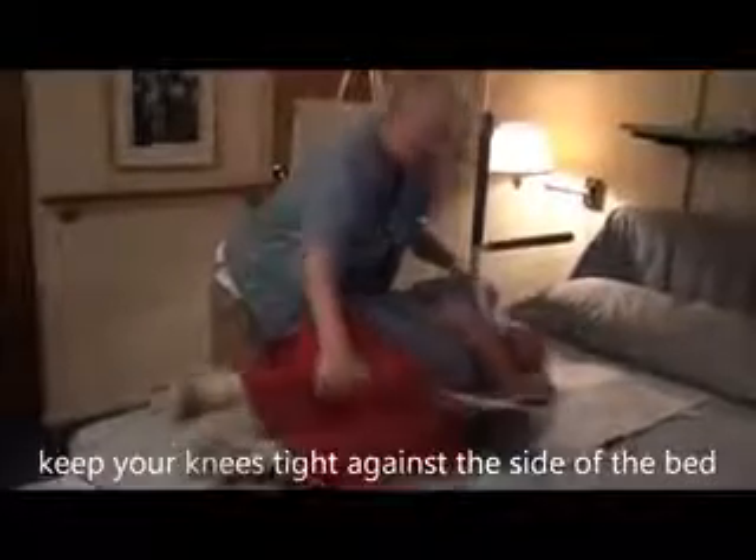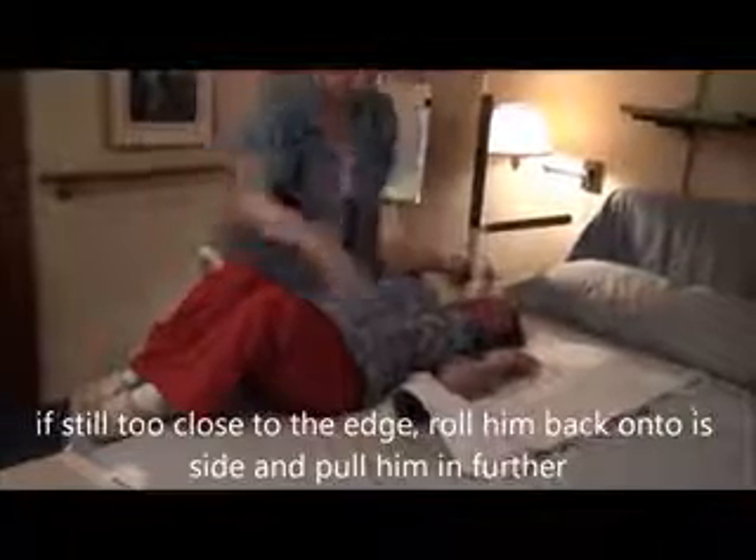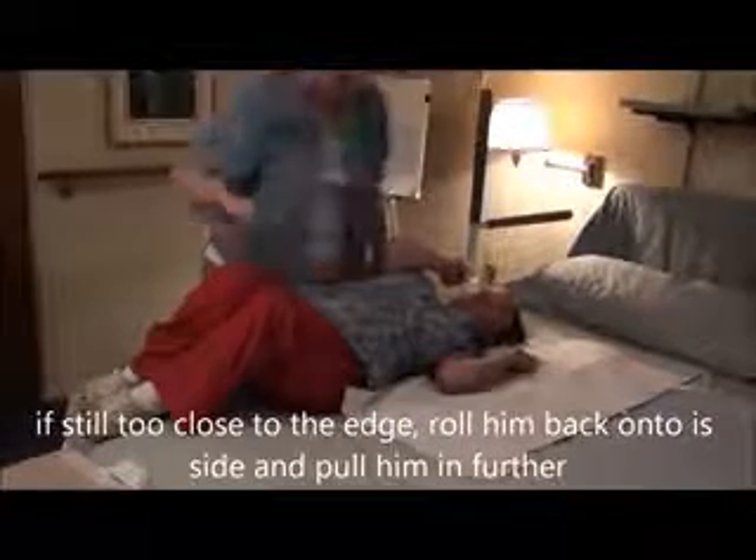First thing I'm going to do is pull his shoulders back so he's more straight. I'm going to go to the other side of the bed. I'm going to pull his knees across so that when I roll him back to get something underneath him, he's not going to fall off the bed.